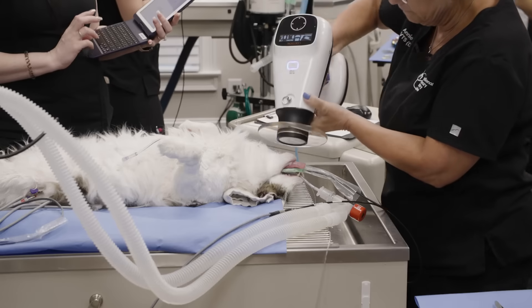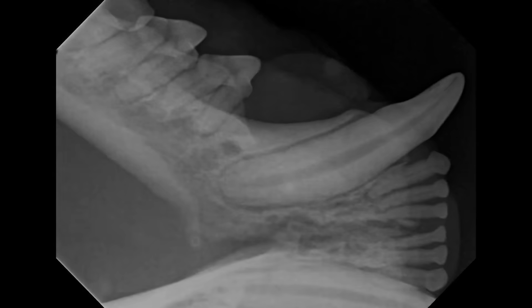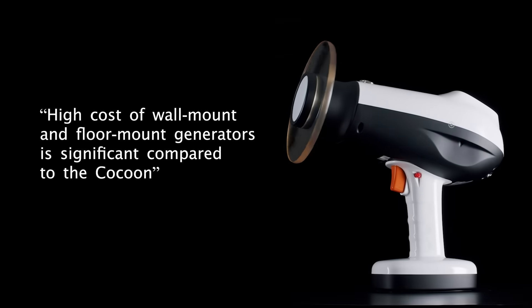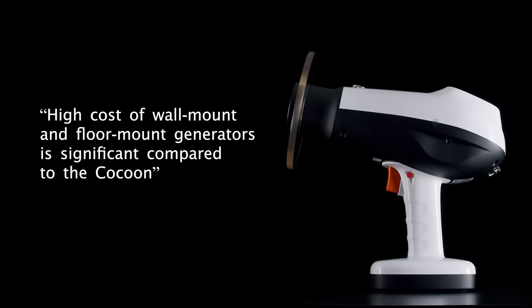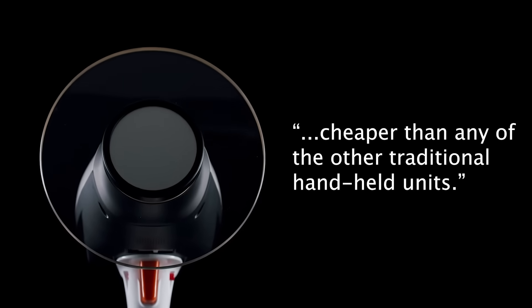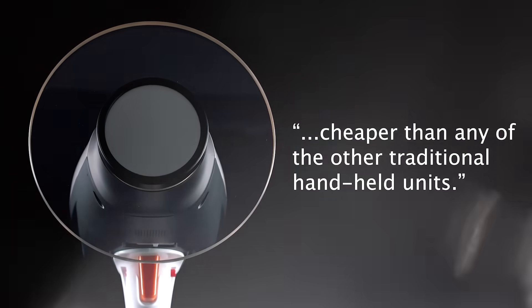One click and you're done. You point, you shoot, and your image is generated immediately. The high cost of wall mount and floor mount generators is significant compared to the Cocoon, and the Cocoon is also relatively cheaper than any of the other traditional handheld units.